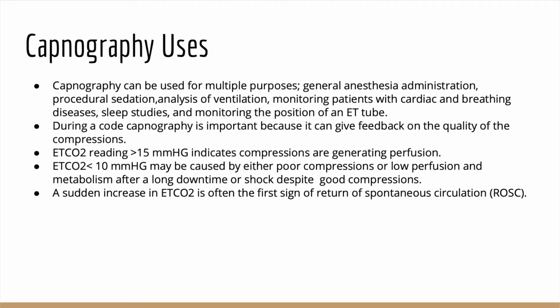Like I showed you on the waveforms, the return of spontaneous circulation, which is what we call ROSC. When you see a sudden increase in end-tidal, that's often our first sign that the patient has developed ROSC.